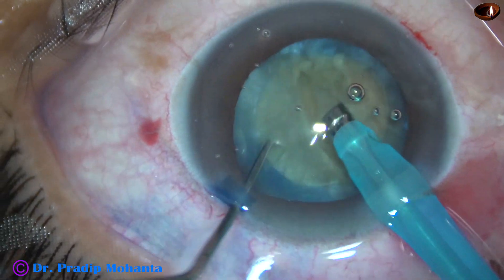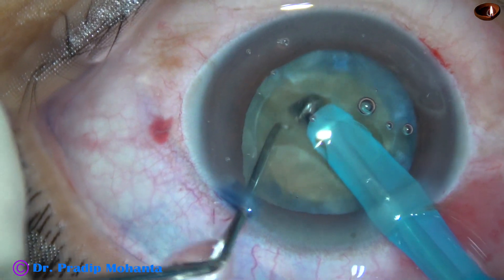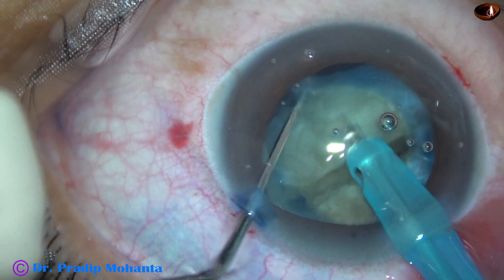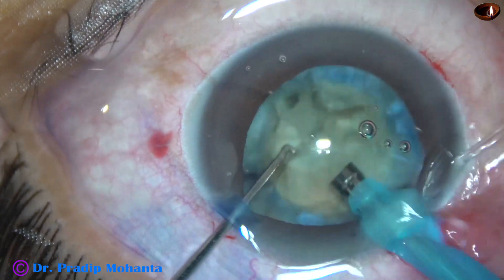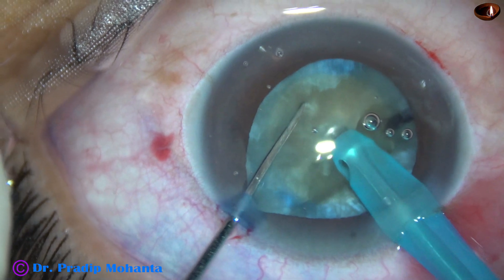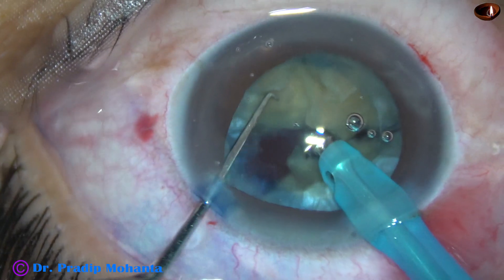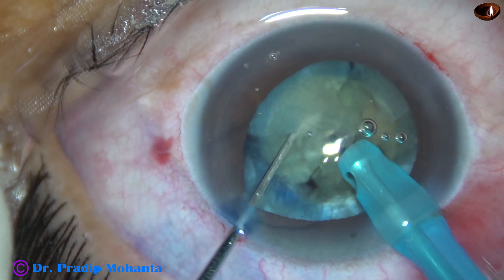Then I rotate 180 degrees, come to the other side, and separate the two hemi-nuclei completely. Each hemi-nucleus is then chopped into two large fragments. The other hemi-nucleus is also chopped into two large fragments. Each large fragment is further subdivided into smaller pieces and they are emulsified.